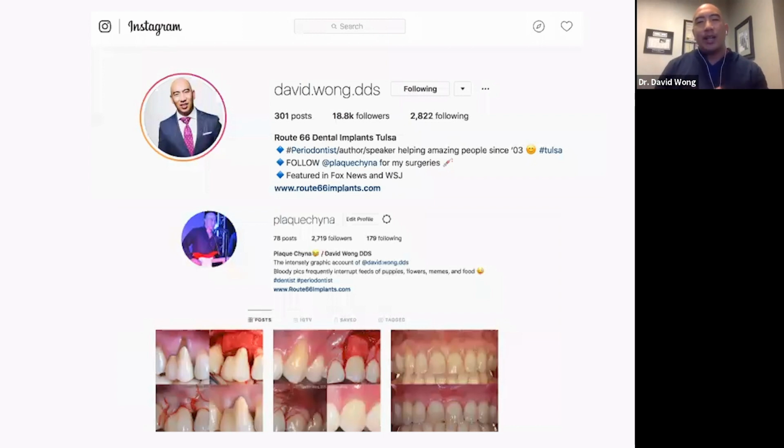The idea here is to keep the papilla intact. So you're utilizing sharp instruments to make incisions around the teeth or implants, and then you're using more blunt instruments to peel the tissue and periosteum off of the bone, and to release the papilla without separating the papilla. So you're not cutting through the papilla. The key point of all tunneling, especially around implants, is to keep those papilla intact, because once you sever the blood supply and peel back the papilla like you would in an envelope flap, you're probably going to get a lot of recession.